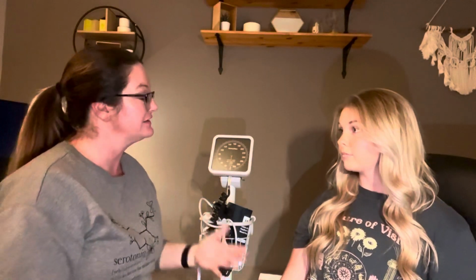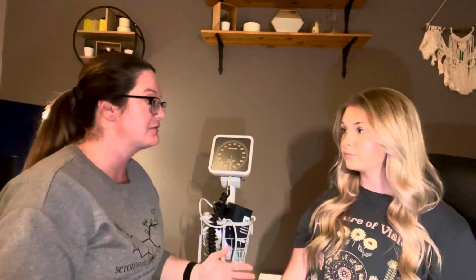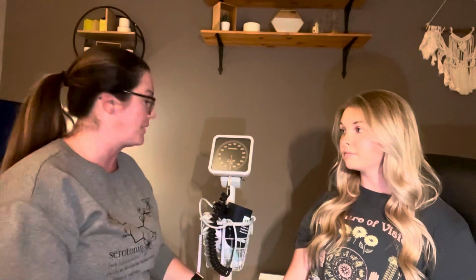So Mariah, do you ever feel dizzy when you stand up? No. Are you feeling dizzy right now? No. Have you drank liquids today and had stuff to eat? Not really. Not really. So dehydration can sometimes cause a little bit of a lower reading. We just always want to check for symptoms, and then you would want to document your findings because it was below that parameter. You're always going to document, but you would want to document that it was abnormal.